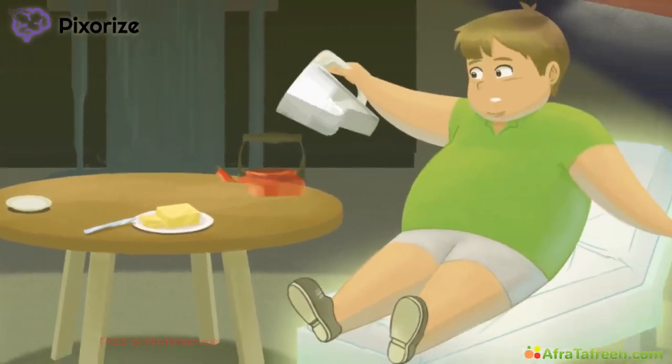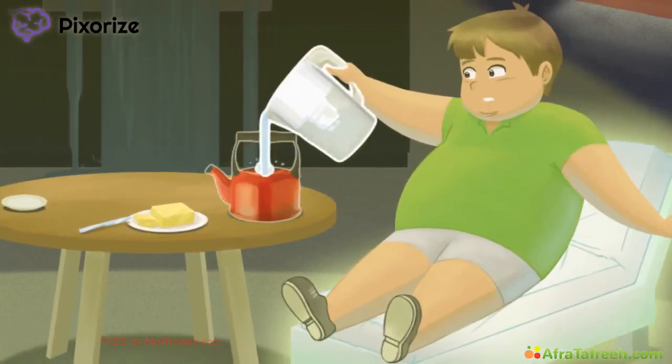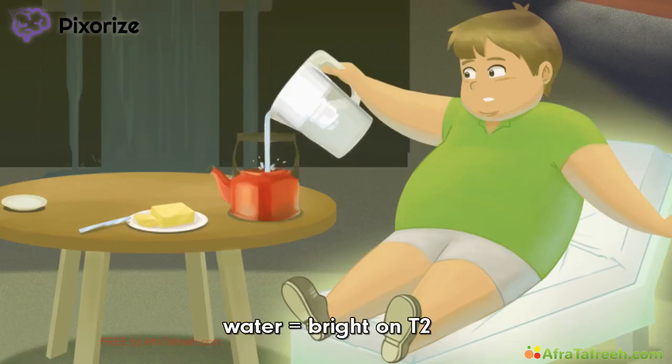Now back to Mr. T2. See him pouring water into the kettle, eager to steep some fresh tea? The pitcher of water is here in the light because, well, you guessed it, water is bright on T2. What clarity. Okay, so what else is bright on T2?